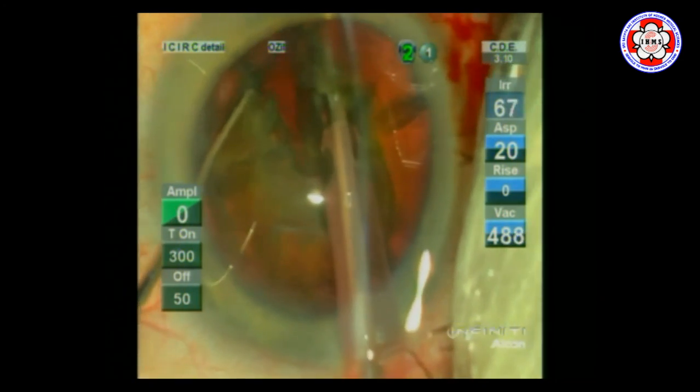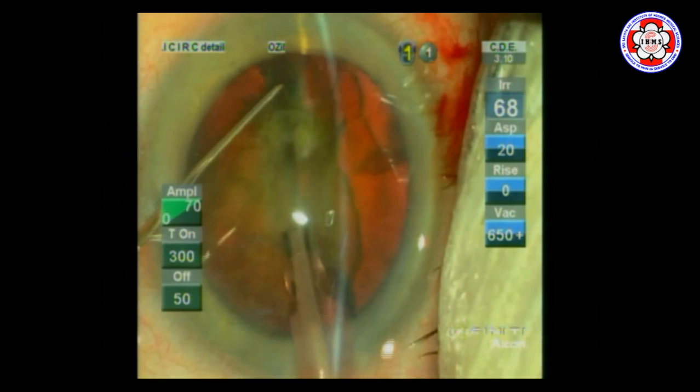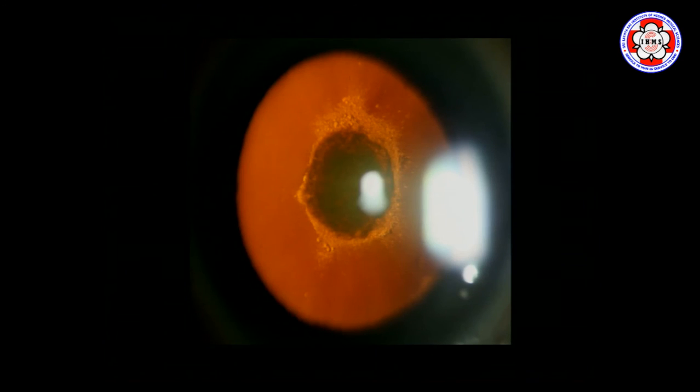So wherever you find it difficult to rotate and the anterior chamber is shallowing, the good idea is to chop first and then rotate. It is not necessary to rotate before chopping. As a technique, we have stopped attempting rotation first — after hydrodissection in our clinic, we now chop or divide the lens first, then rotate. Intraoperative capsular block is a more extended version of this, where the posterior capsule can actually burst open because the hydrodissection was not decompressed.